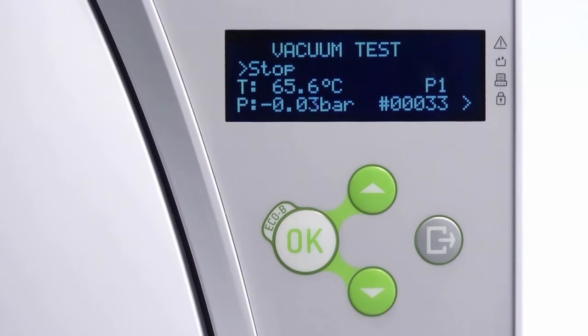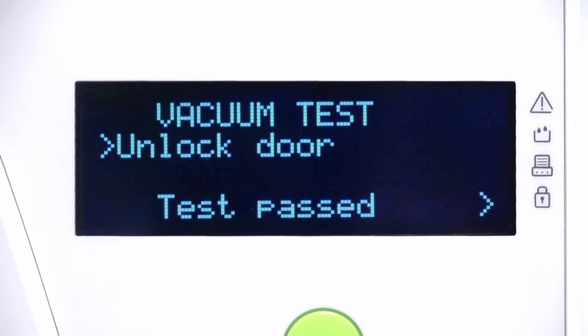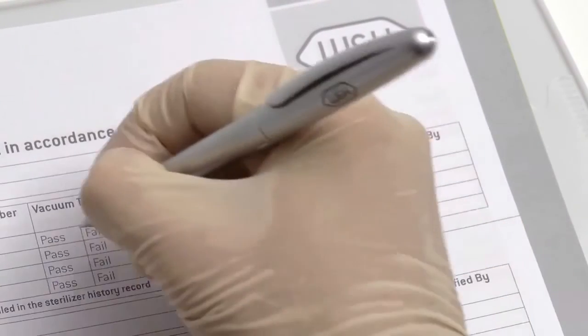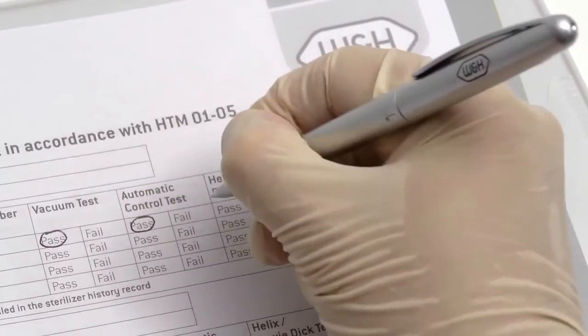Once the vacuum test cycle has been successfully completed, the display panel on your Lina steriliser will display Test Passed. Once the door has been opened, the menu display will indicate your Lina steriliser can now be prepared for daily testing. All test results should be documented in a logbook specific to the steriliser, in accordance with National Decontamination Guidance.